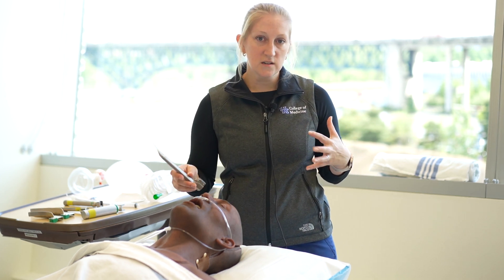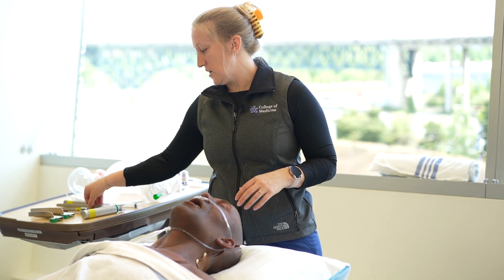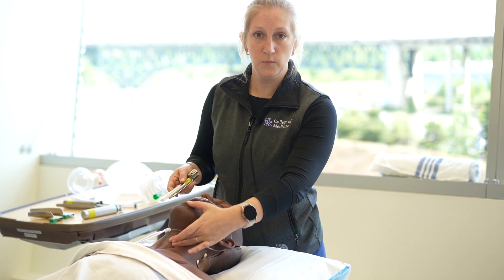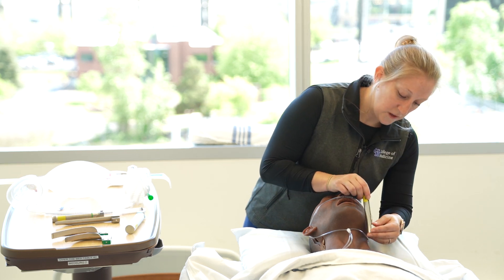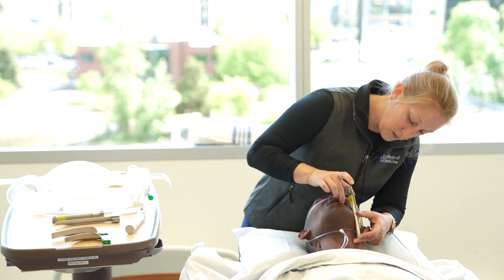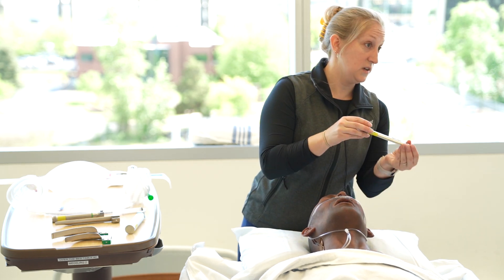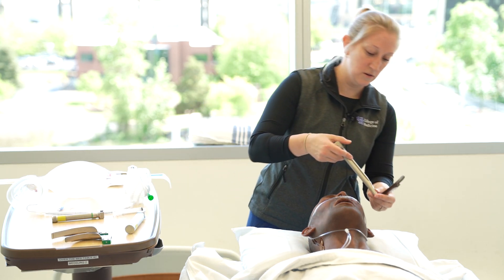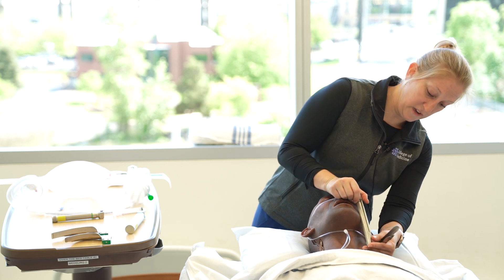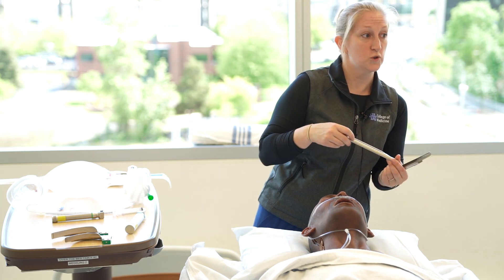We're going to talk about placement, view, and how to choose a size. Just like with Mack blades, you're going to measure from the hyoid bone up to the lip. The same thing applies for the Miller blade — measure the end of your Miller blade from their hyoid bone up to their lip. For this gentleman, a Miller 3 is actually plenty. You can see that a Miller 4 would be quite long, and you may accidentally put the whole blade in too aggressively, which is going to obstruct your view if you use too big of a blade.